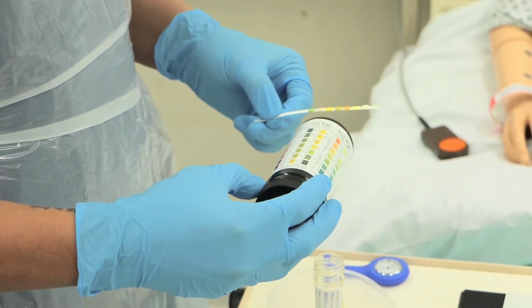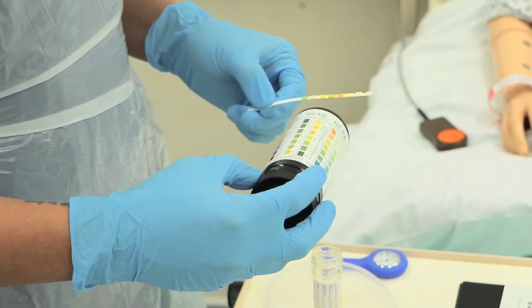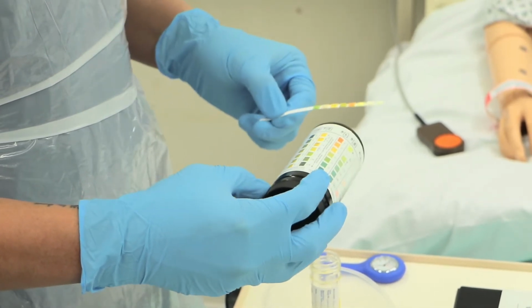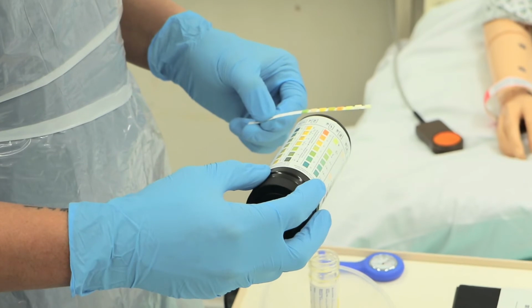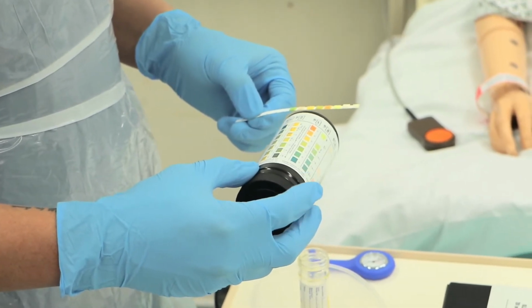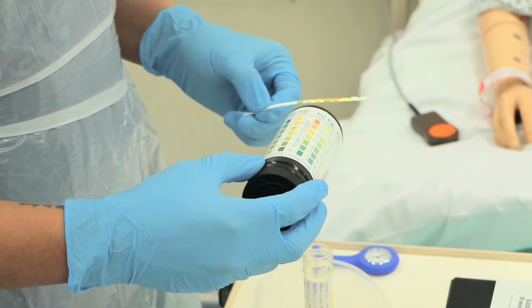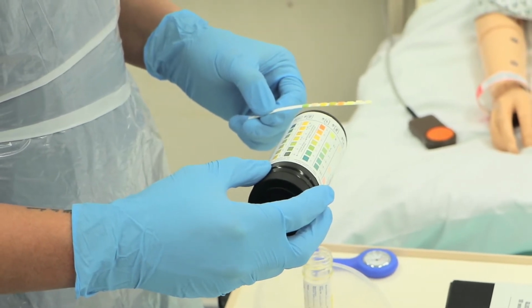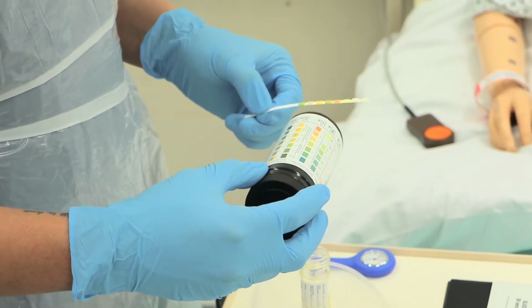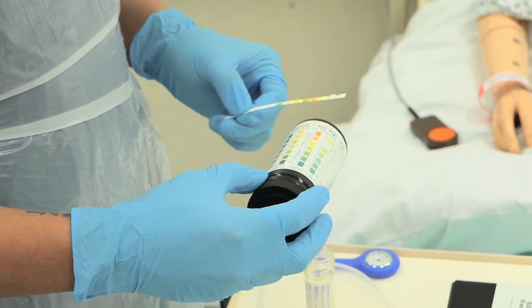5 seconds for specific gravity. 1, 2, 3, 4, 5. Specific gravity is 1.030. Another 15 seconds for blood. 1, 2, 3, 4, 11, 12, 13, 14, 15.